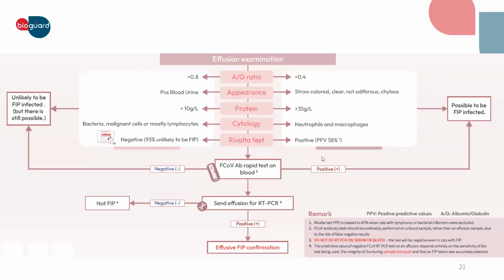Variations in the sequence close to the characteristic mutation in FIP, can they cause any interference with the binding of the detection probe? Sorry, Francisco, could you please elaborate your question, or maybe you can write it and we can answer you later?